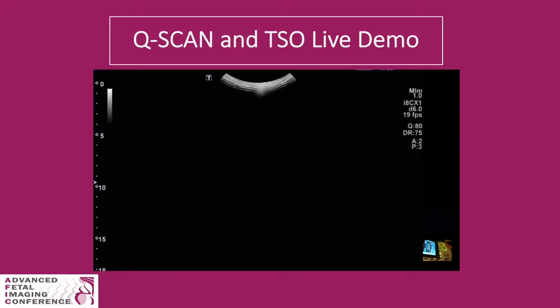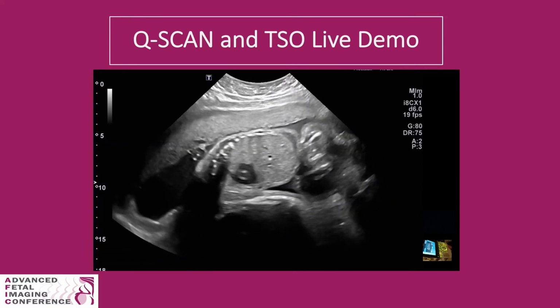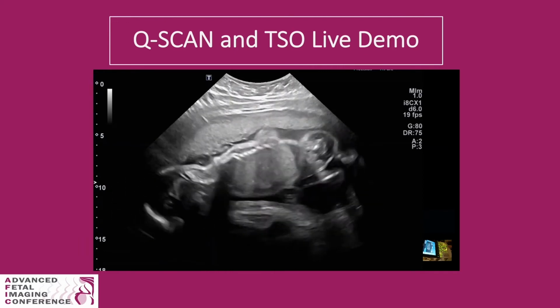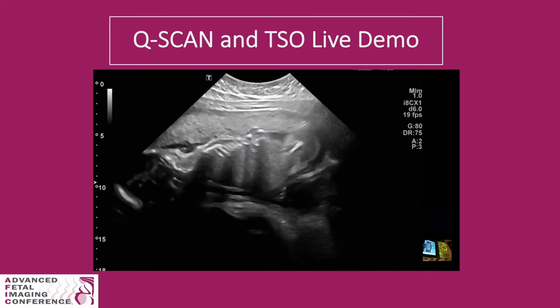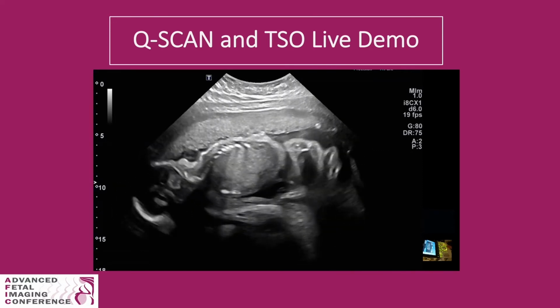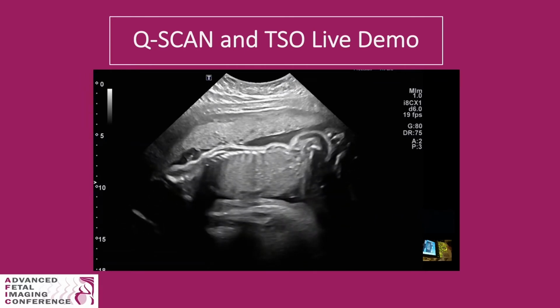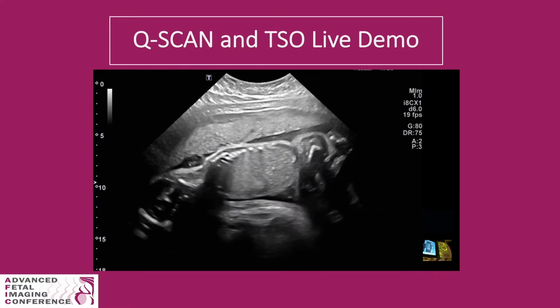Okay, so once you've selected your preset and you're ready to begin your exam, it's typically important to activate the Qscan to have a good baseline throughout your entire image. So Qscan analyzes the entire field of view and adjusts the overall gain to even out your image and suppress noise in any cystic structures, so fluid or any cysts that you might come across in your scan. So I'm going to begin the scan, put the probe down here, and right off the bat my image looks like this. It's too bright in the near field, too dark in the far field, reverb in the fluid. So I can manually adjust these features with the gain and the TGC.